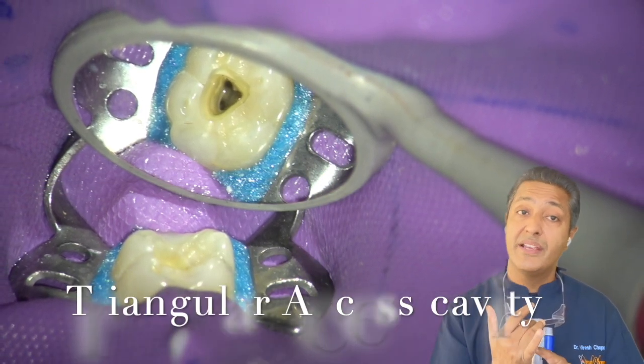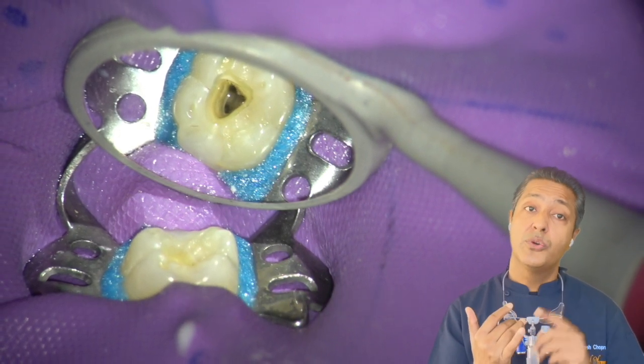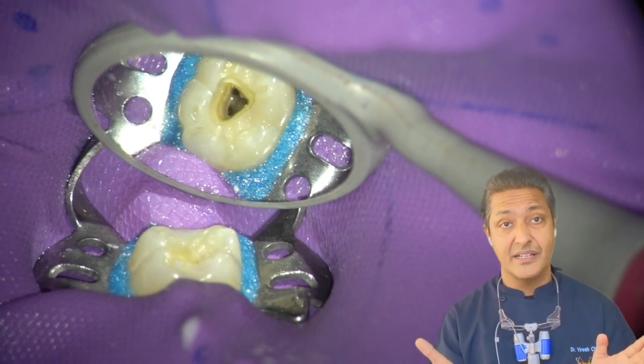So when there are three root canals in a mandibular molar, namely mesiobuccal, mesiolingual and distal, the shape of the access cavity is triangular, with the apex of the triangle towards the distal side and the base of the triangle towards the mesial side.